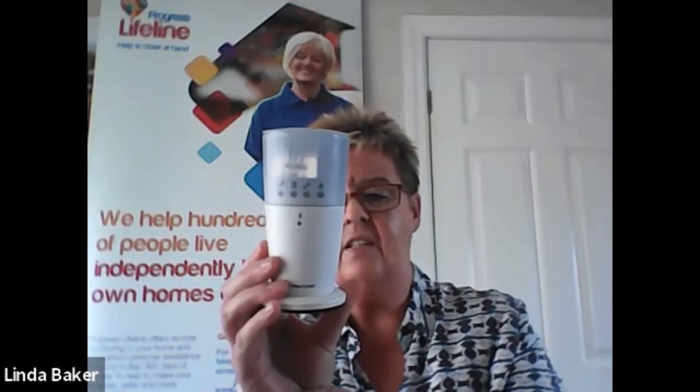I could just ask you, so the beacon, is that something you can move around the home? Yes. Okay, and it's on a battery, obviously, so you can take that anywhere you wanted. It's actually got a little power lead, but I think that's a charger. I would have to check back at the office, but I actually think that it's a little charging point there. It may need to be plugged into a socket. I can check that for you and get back to you. Yeah, it looks like it's got a battery in it. Yes, there's definitely a little battery sign here. Yes, I will check that for you.